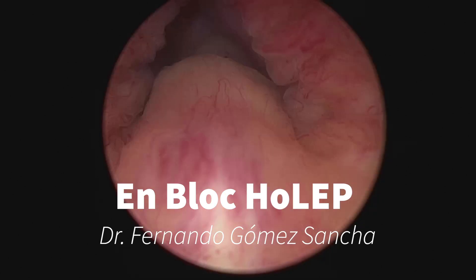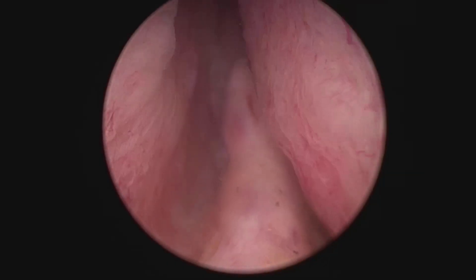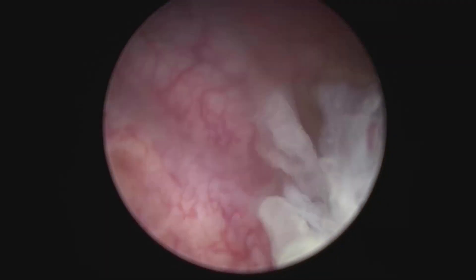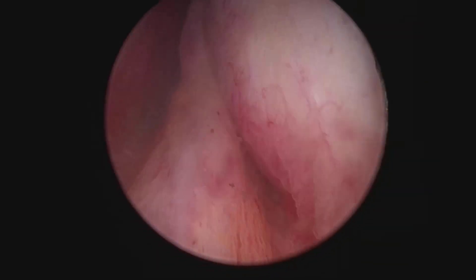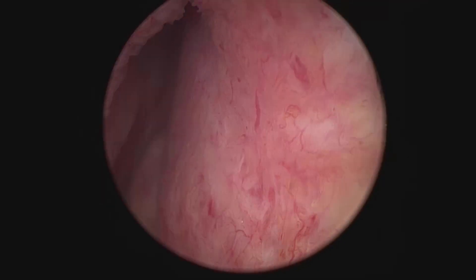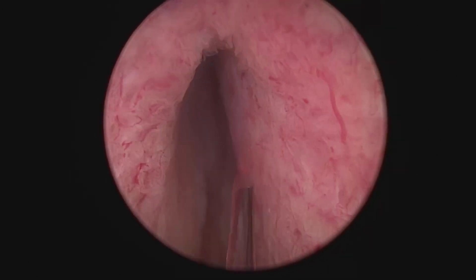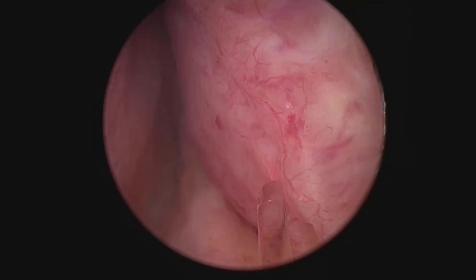Hello, this is Fernando Romés Sánchez. I'm going to show you a case I did yesterday. This is a man with a relatively bulky prostate. The ultrasound estimation was 90 grams using an abdominal ultrasound, maybe a little bit smaller as ultrasound tends to overestimate the prostatic sizes. I'm going to show you the nBlock technique. It's very beautiful, amazingly fast, and I think it's going to change the way we see Holmium enucleation of the prostate.